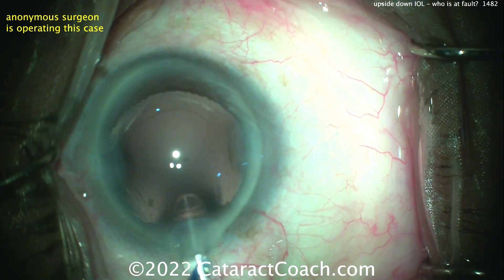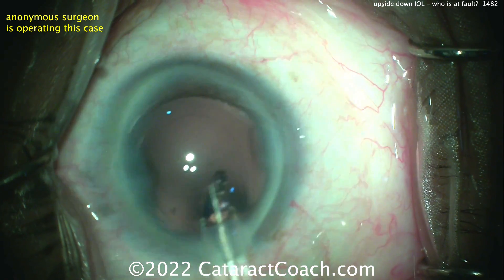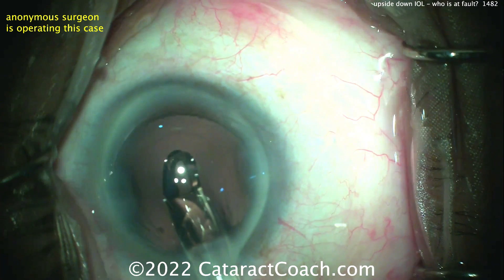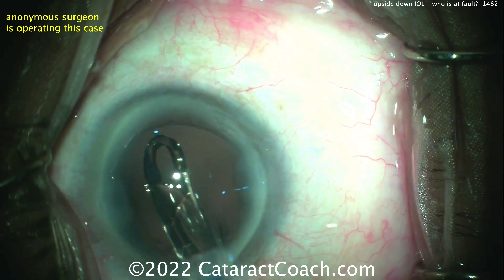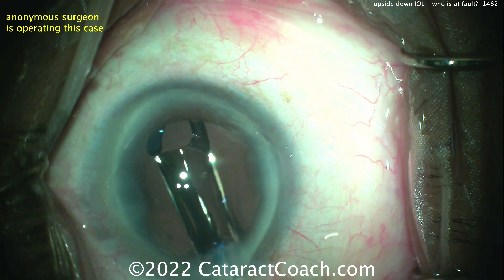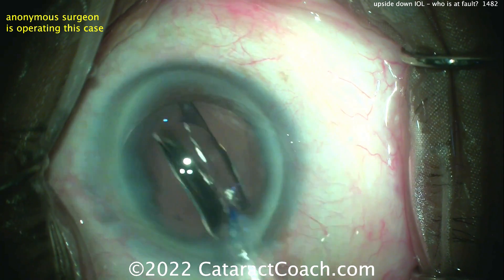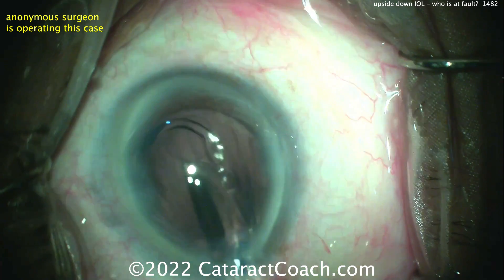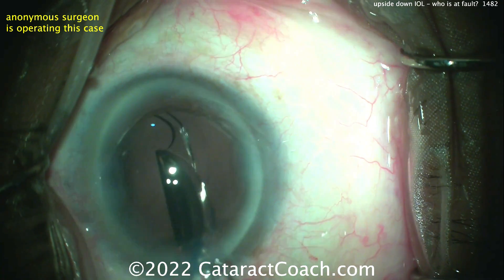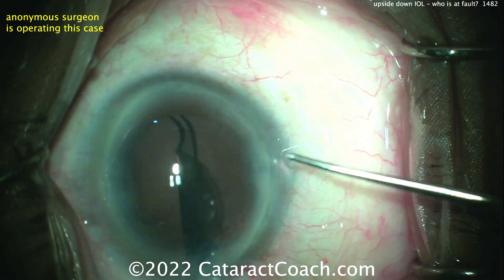Watch carefully — think about the 7L rule. The first haptic should look like the number seven, and it's wrong. So right now we need to flip it: keep turning, keep turning — all right. Now the lens is in a partially correct orientation with one haptic still outside the eye.